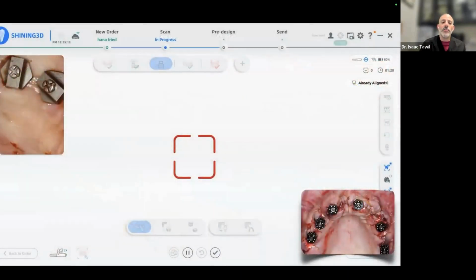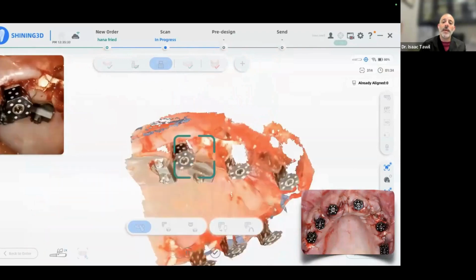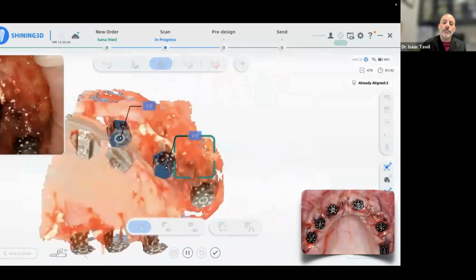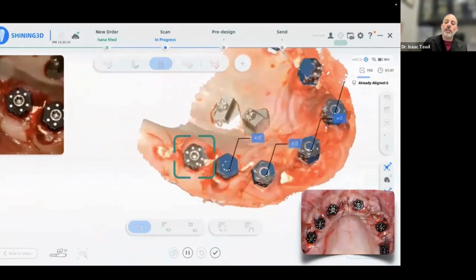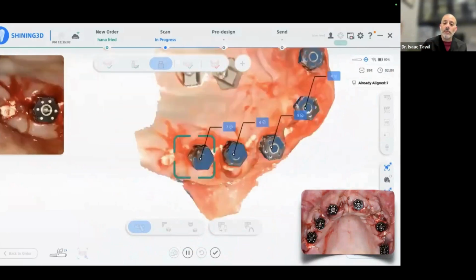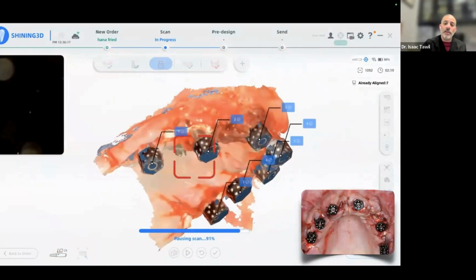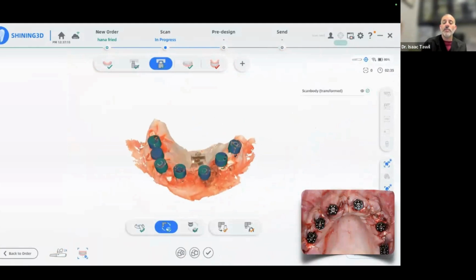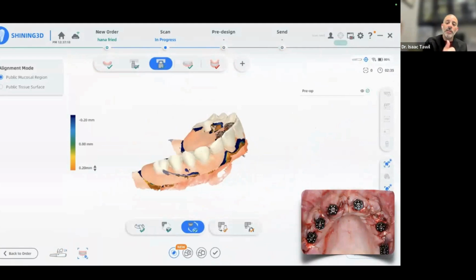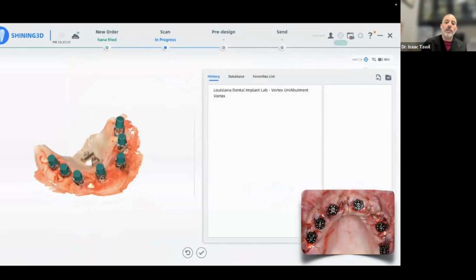We will go ahead after we suture everything up and we will capture. This will take you through the workflow here. It'll go and capture all the tissue, and then we will CAP scan each one of these and they will turn blue. You don't have to get all of them. You only need 3. But if they all turn blue, you're going to get perfect alignment every time. And if you don't, it's okay. We have a manual option as well for that. So we built all this in so that there is a fail safe just in case. But you can see everything's lined up and matched nicely to where now all the layers are matched. Our initial scan with the fiducial marker, our photogrammetry, and of course our tissue scan.